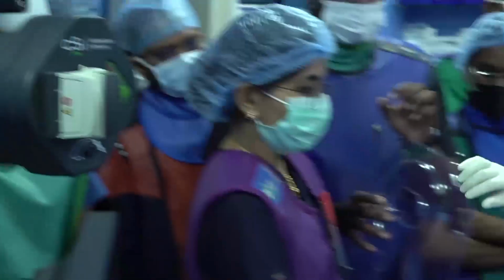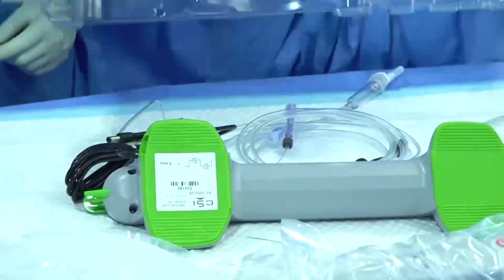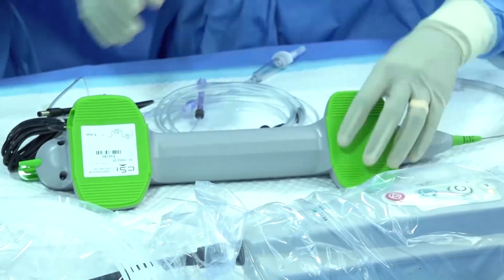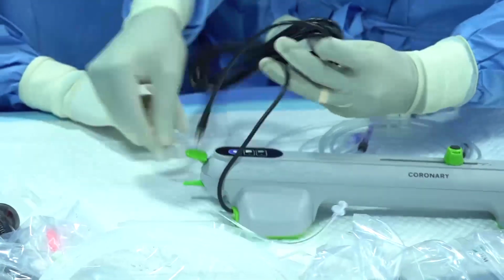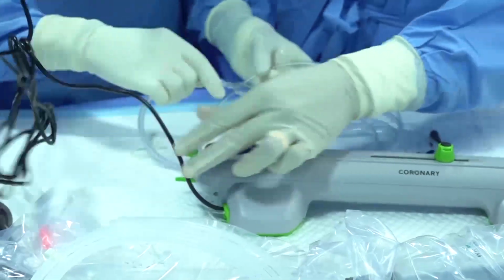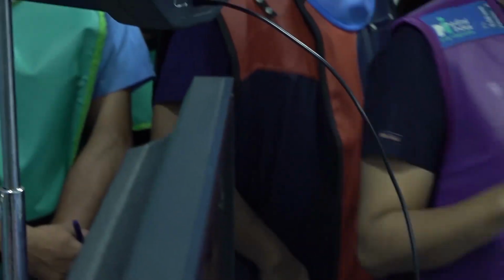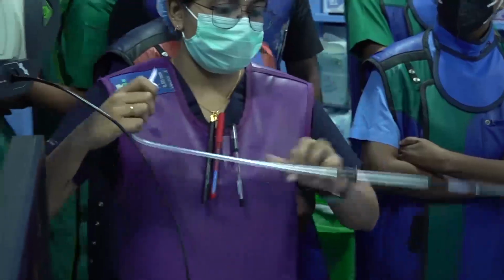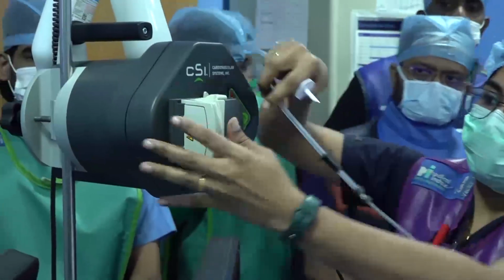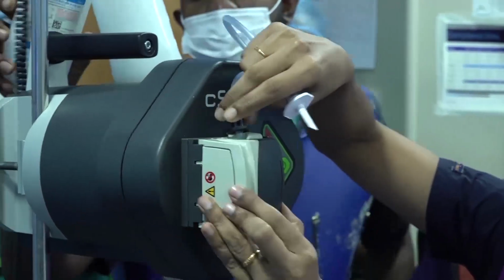Now can you focus over here? Here it's again something similar to the rota. You just have to put it upside down. Okay, now here we have the wires. That's for the electricity for the motor. Then we have the tubing for the saline. Yes, so that is a roller pump. You have to fix the tube.